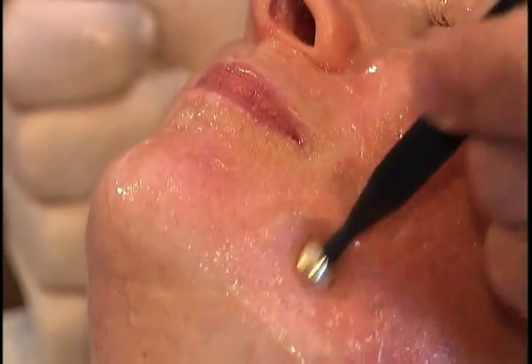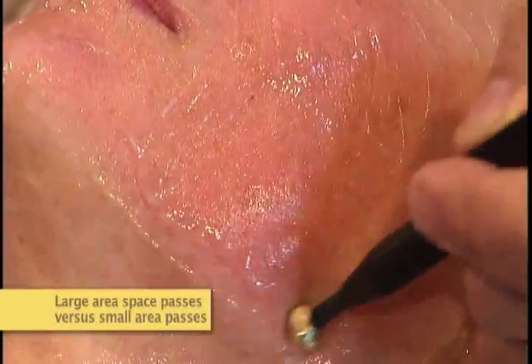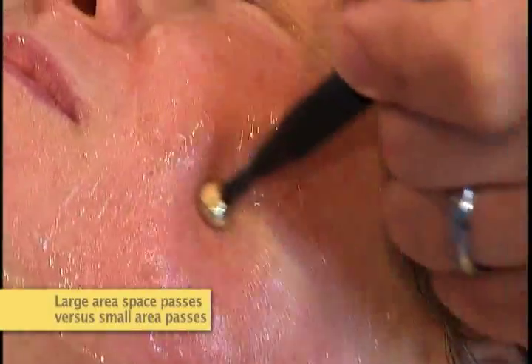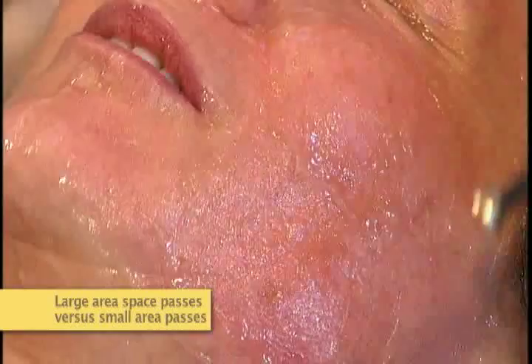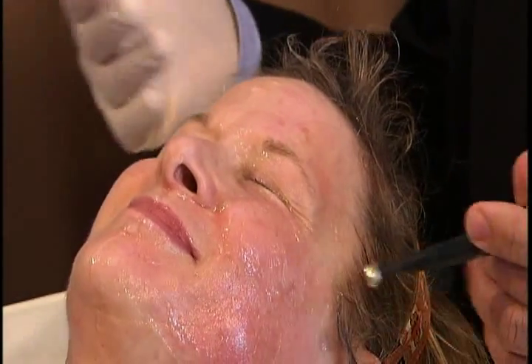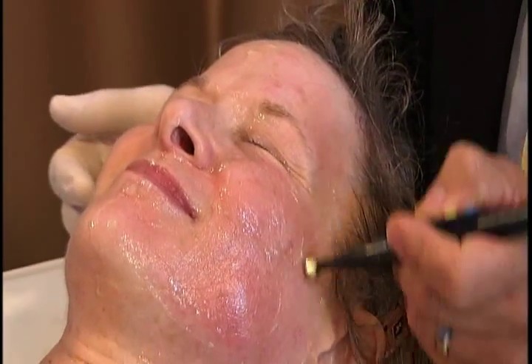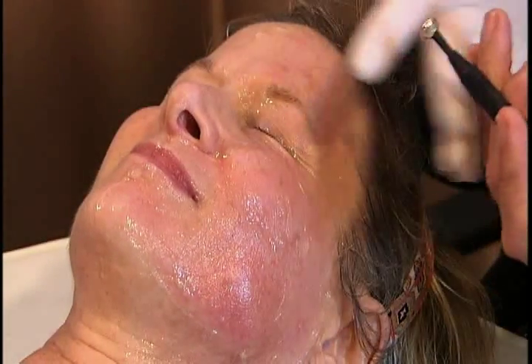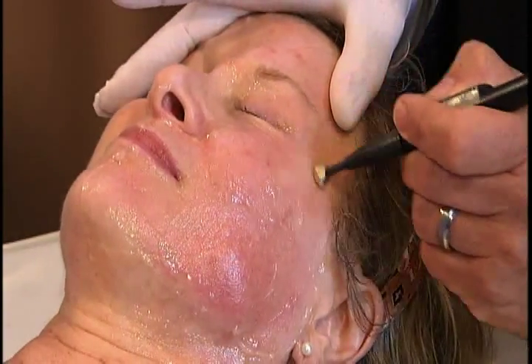Where are you from on a scale of 1 to 10? Where is it heat-wise right now? 5 or 6. Okay, so watch what happens at 5 or 6. If I decrease how much area I'm covering, it only takes a little bit of time to get up to 8. Yeah. So you just kind of know. You'll learn. My patients realize that if I'm asking, is that too hot, they know it's about to get too hot. Because I know from the redness, and again, I'm feeling heat radiate off the patient on the back of my hand. I know that I'm getting close.